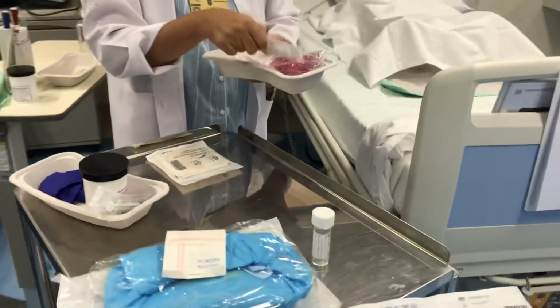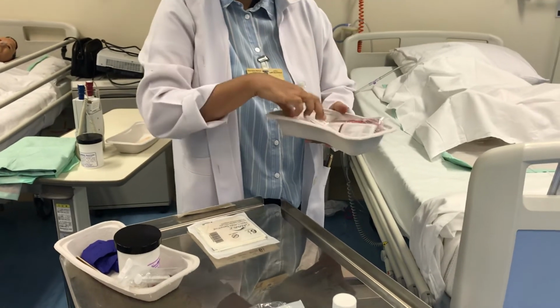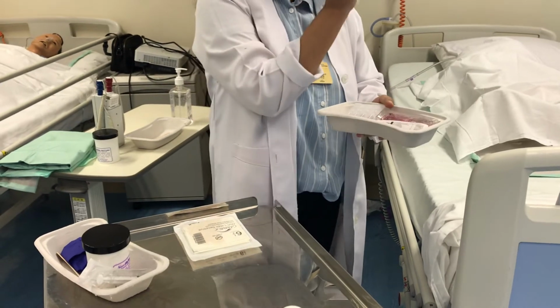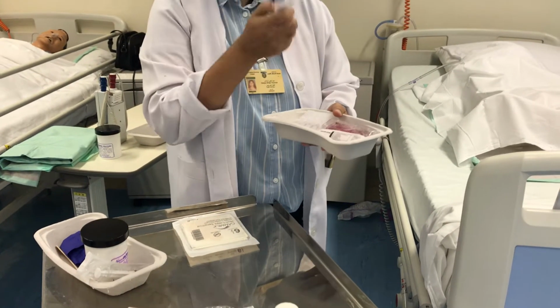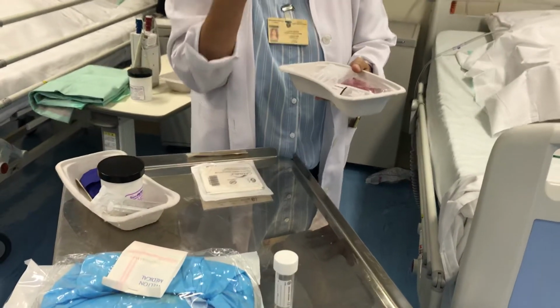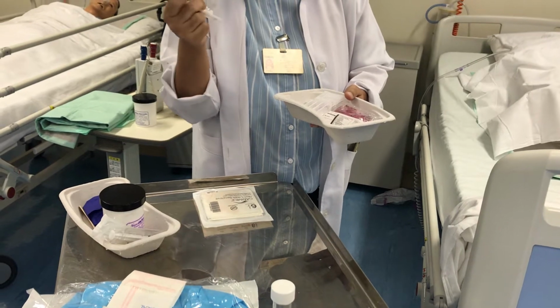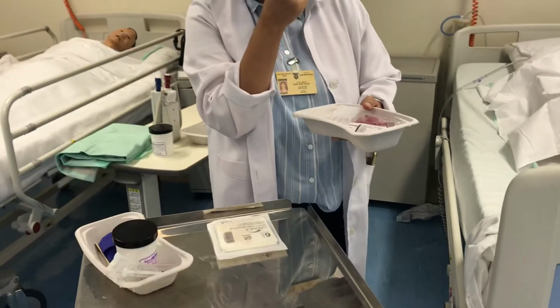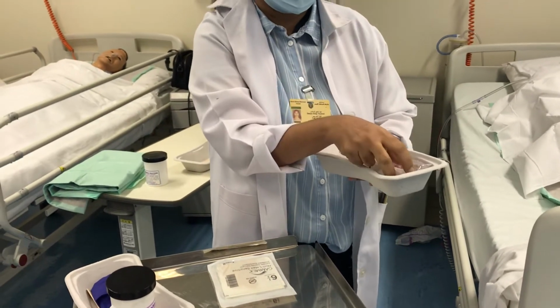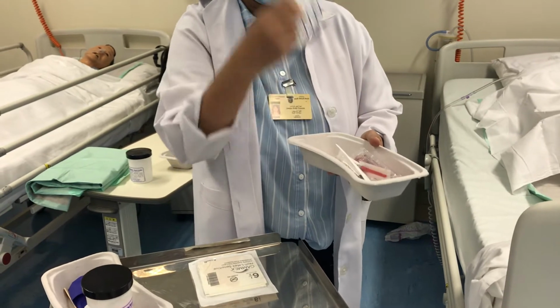Yes. Then why we need this syringe and needle is to inflate the bulb of the catheter. So we need to inflate sterile solution into the catheter just to check whether the catheter balloon is patent or not, because we need to keep it inside. We need to inflate the balloon inside to hold the catheter. So for that purpose we need the syringe and the needle and also the sterile solution.